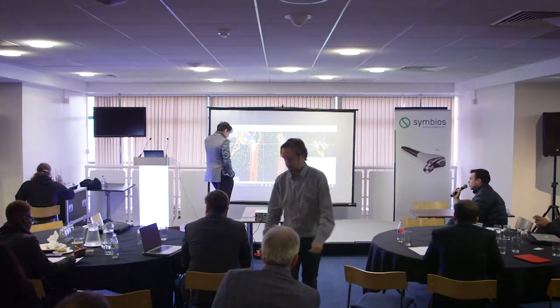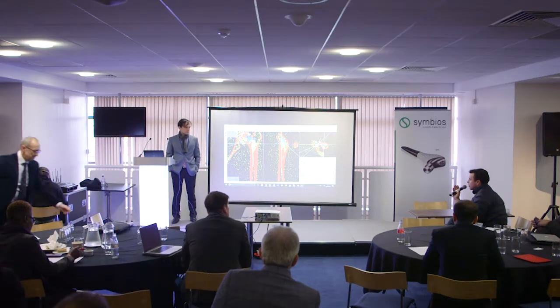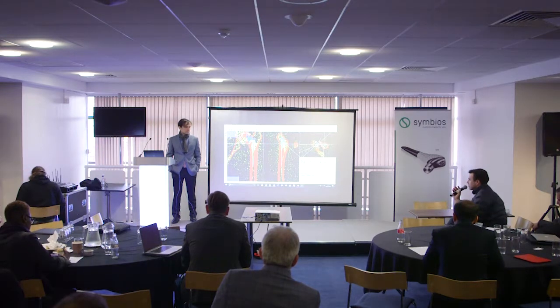If you have a patient with a valgus femoral neck with reduced offset and you want to normalize that offset, how far can you push that femur out laterally before you get concerned of increased soft tissue tension? To be honest, I always avoid to increase the femoral offset. So I will not tend to increase it. I will leave it with his or her morphotype, especially the valgus in women. The valgus in women, especially when they are over 50, they don't tolerate at all any kind of increase in the femoral offset, especially if there is a lengthening.